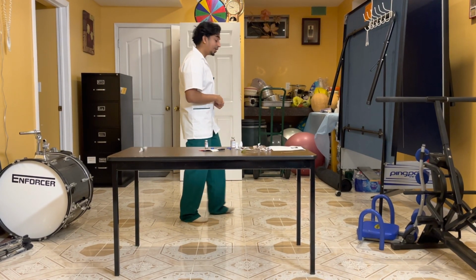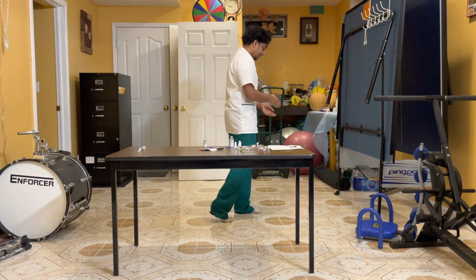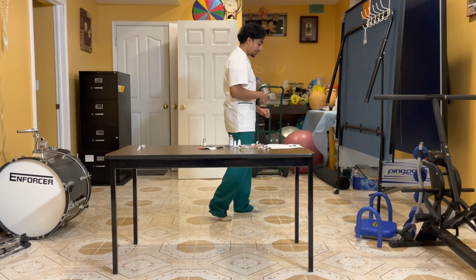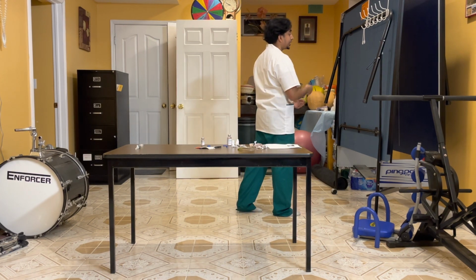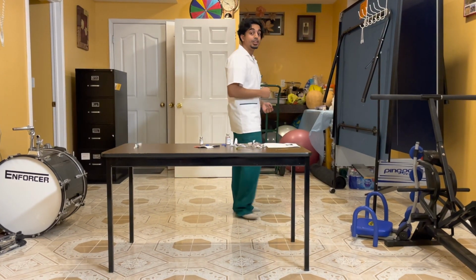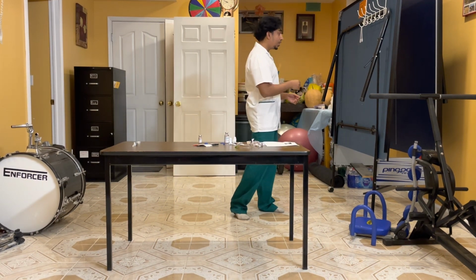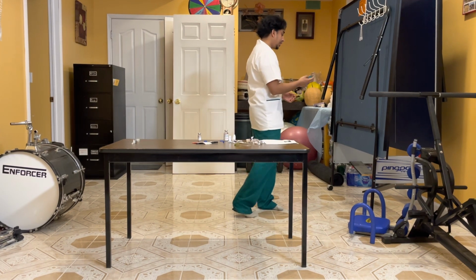Now that I've done that, I'll assess the current IV line. I make sure there's no issues, there's no redness, no swelling around the injection site. I also check the saline lock. I make sure that it is adequate and locked. If there's any issues with the saline lock, I will flush it out. I will wipe it down with alcohol, let it dry, and I'll insert the new saline.